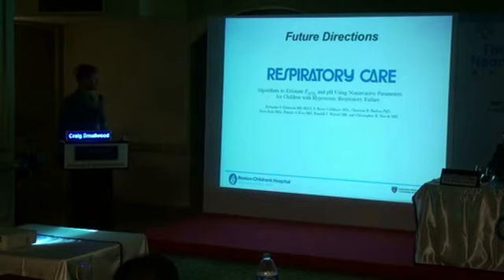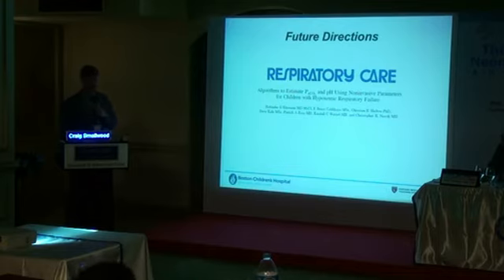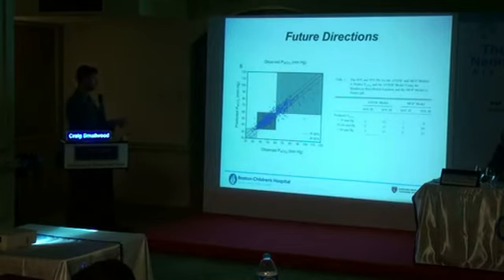These researchers published this in Respiratory Care, obviously, in children with hypoxic respiratory failure. What they wanted to do was automatically detect or compensate for those gradients that we talked about. So remember we talked about the PaCO2 to end-tidal CO2 gradient and how it can be a little bit tricky to clinically interpret at times. What they wanted to do is find a method to do that automatically for us. And I'll leave you with this slide, but essentially they weren't that great.